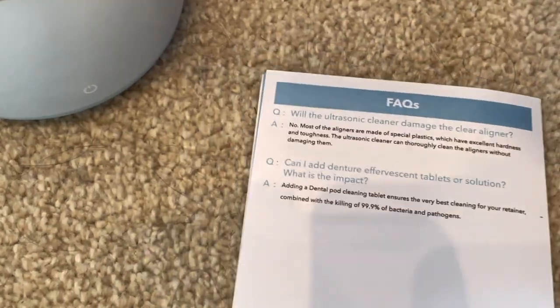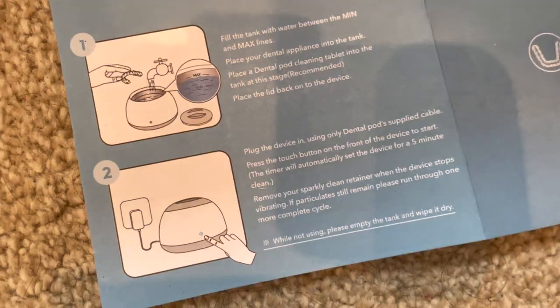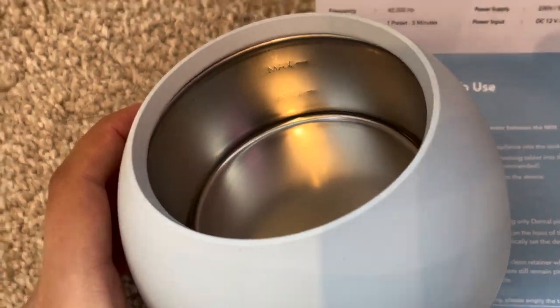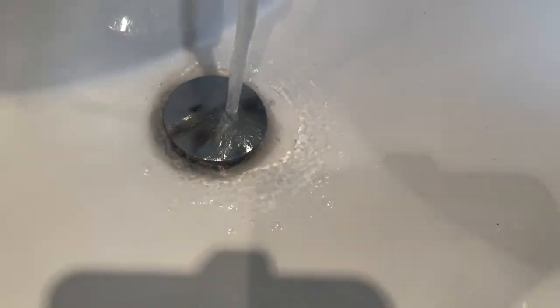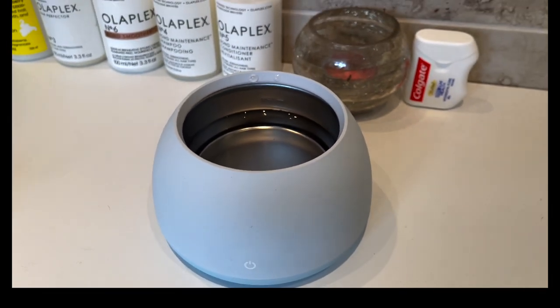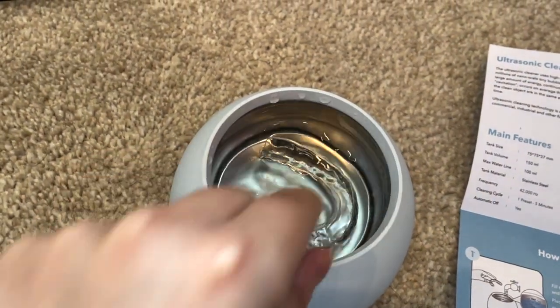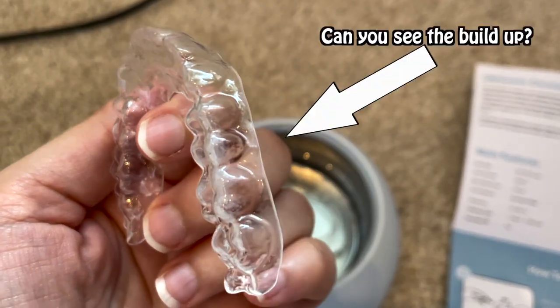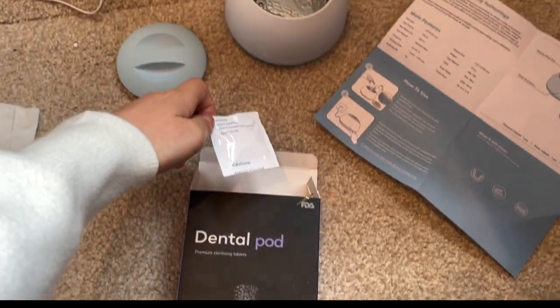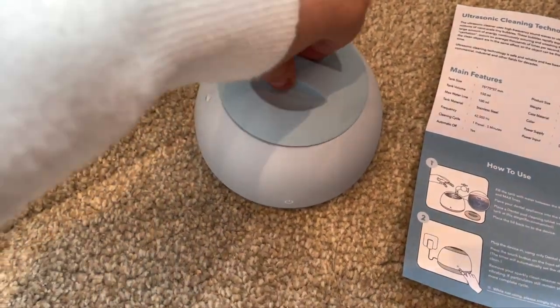The user manual says it cleans up to 99.9% of bacteria and pathogens. It says to fill the tank with water between the minimum and maximum lines. So as you can see, it's between those lines and now we're going to pop my retainers in. We're just going to take a tablet and pop it in there — tablet in, lid on.